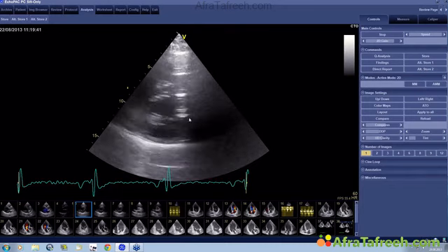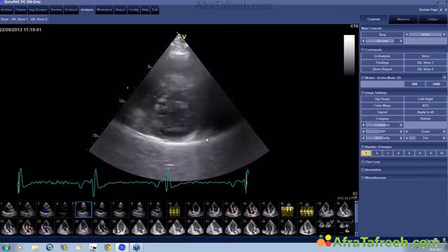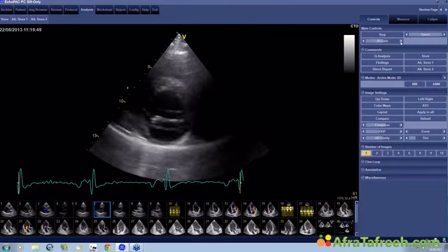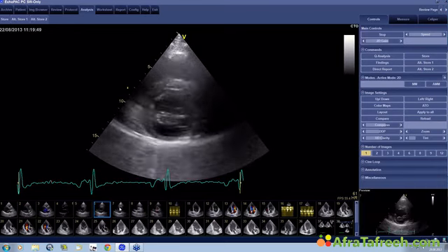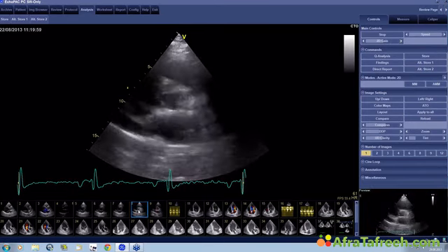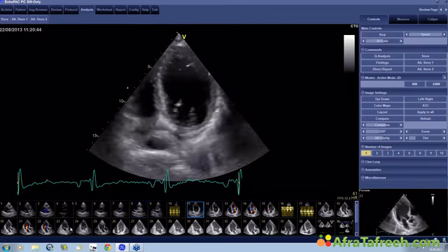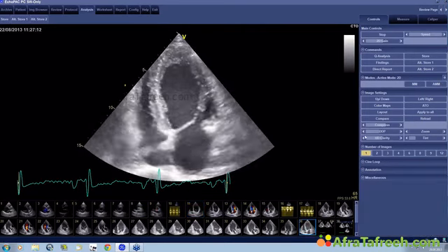However, be cautious, we're very close to the mitral valve here, right? So usually function down here is less than in the further apical parts. But if you just move down a bit, this kind of spreads further down as well. So you can confirm the diagnosis if you use several of these short axis views. And now let's turn to the apical views. This is an apical. I'll just show you this one is better.